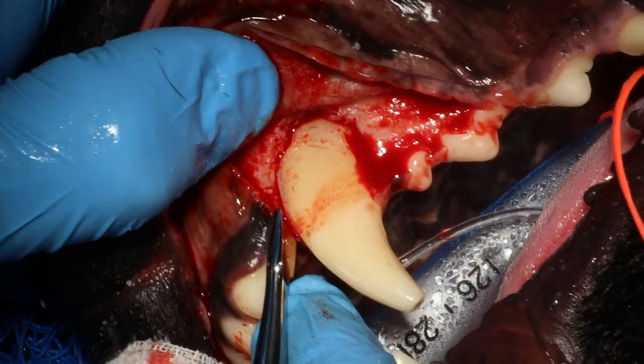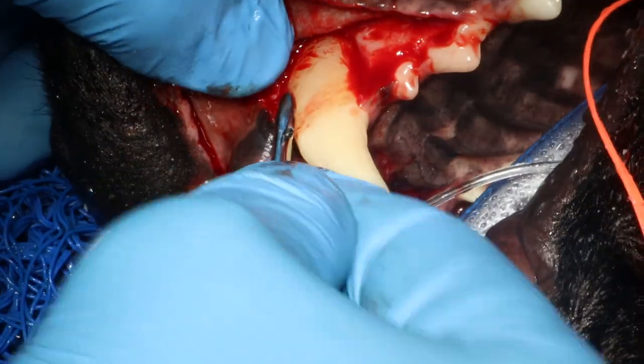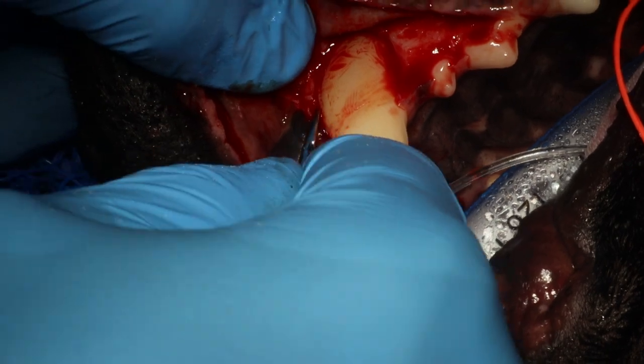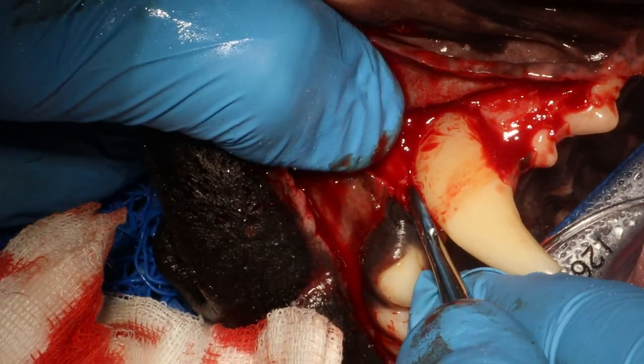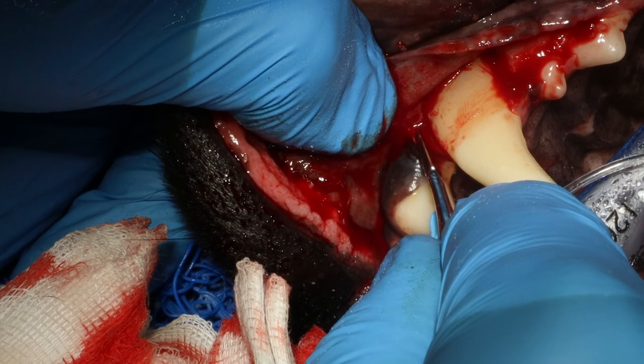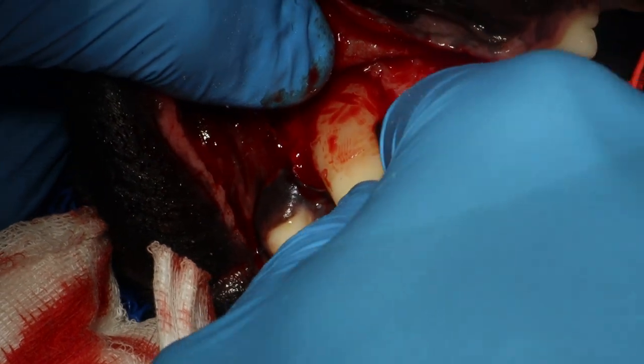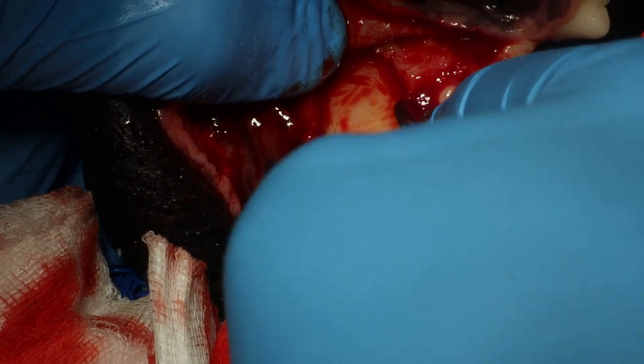Here I'm going for a slightly larger luxator that fits the tooth. This area is very dense — there is a lot of dense bone on the mesial aspect. If you can get it in there and twist, you can check for movement of the root. I'm jiggling and wiggling it while applying firm pressure, and right now I'm able to get it quite loose already. I don't have to destroy my wrist with excessive luxation because I removed so much bone.